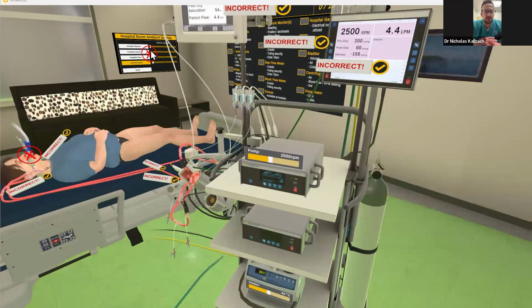We also have several different areas that you can interact with the circuit, including pressure monitors. We have pigtails that we use in order to deliver either blood products or perhaps sample the blood in order to do various tests to it. And we also have a bridge, which is a connection between the return side as well as the drainage side, that allows us to flow our circuits despite whether it's being delivered to the patient or not. And in those instances, we may be clamped off to do some sort of trial, and we want to make sure the circuit doesn't clot off.